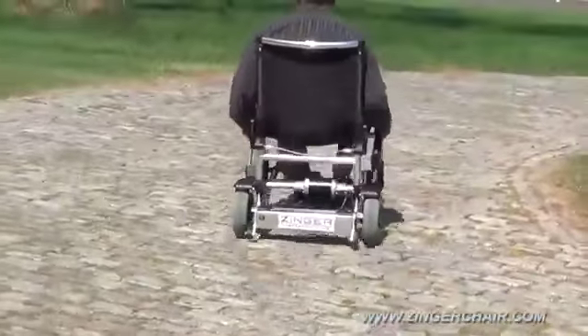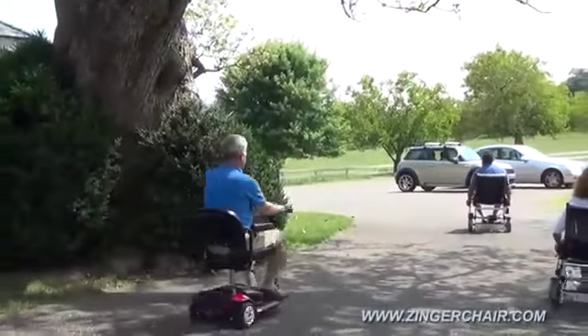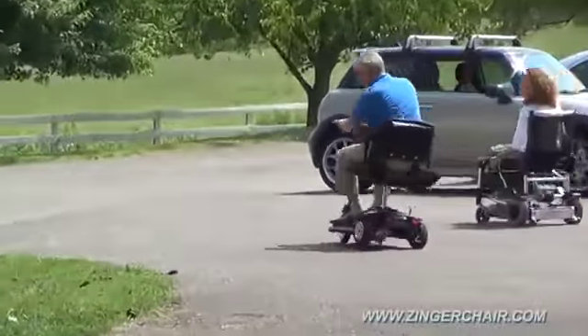Outdoors, the patented Zinger Drive tracks straight and true by effectively locking the rear wheels together. And unlike handlebar-steered scooters, this unique drive system keeps all four wheels on the ground when rounding curves.